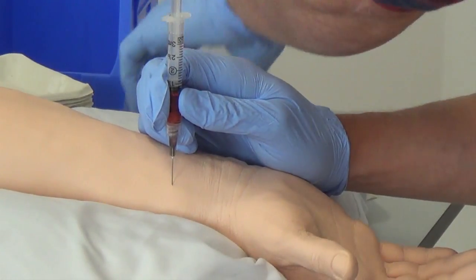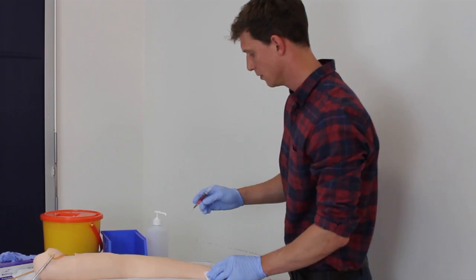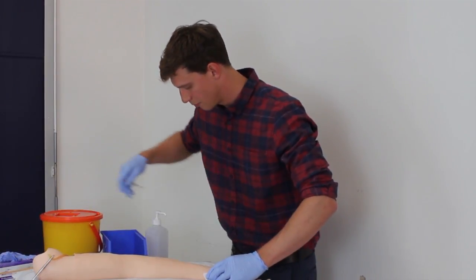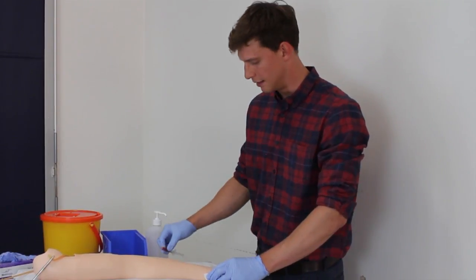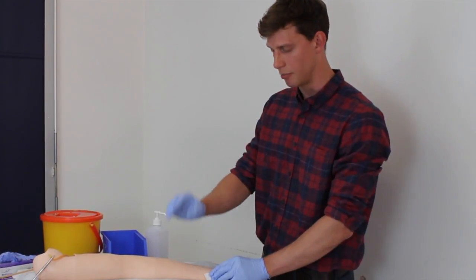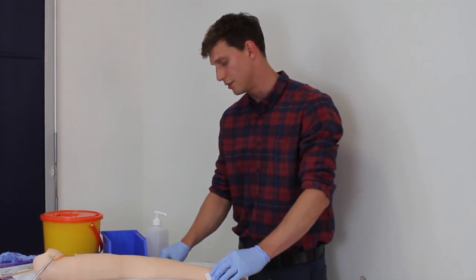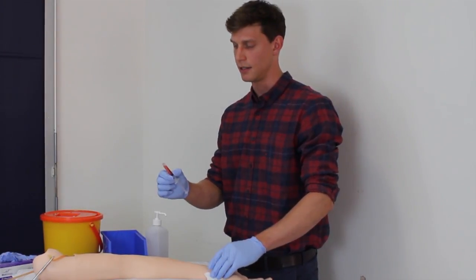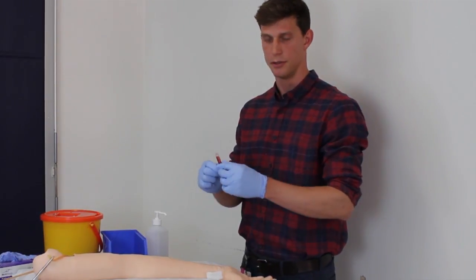I get my gauze and place it over as I retract the needle, then immediately discard my sharp. Time is of the essence — I place firm pressure with the swab and ask the patient to do so for about five minutes to ensure the blood clots. Whilst doing that, I confirm the correct patient details are labelled on the syringe, then take it to the analyzer as quickly as possible.